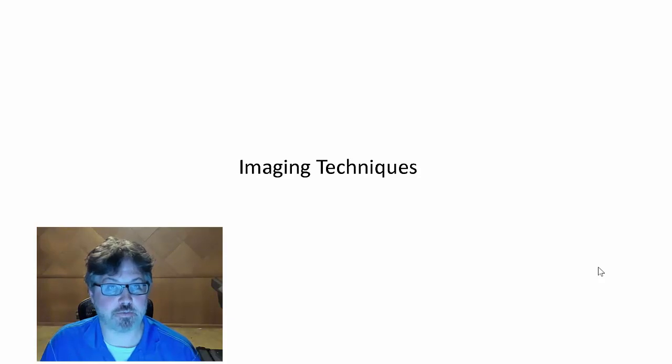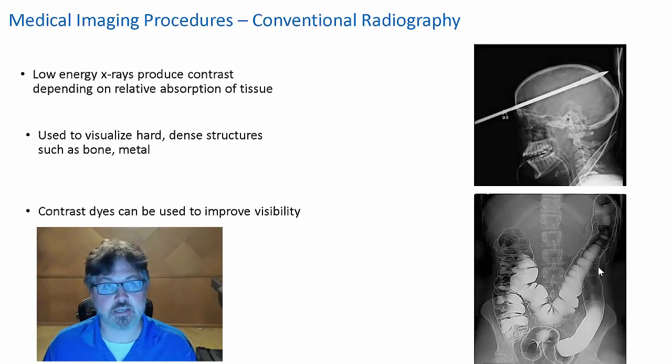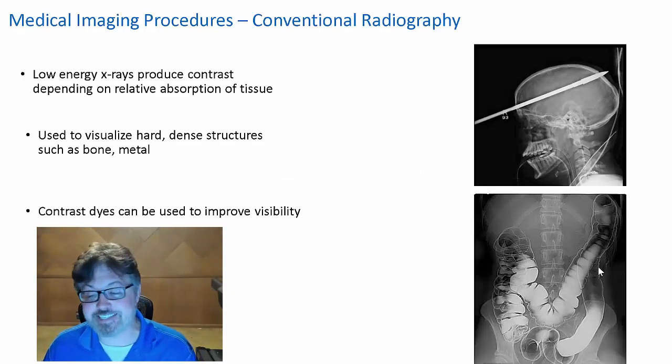I just wanted to add this little brief introduction into imaging techniques. Like I mentioned in lecture, you guys are going to be talking a lot more about it as you get into radiology and whatnot, but you certainly want to understand some of these techniques and what you're looking at in some of the radiographs, and how these different images are obtained, and when you need to decide to use which imaging technique, depending on what you're looking at and depending on some of the risk and benefit situations. So, of course, one of the most conventional, easiest things that we can do is conventional radiography.